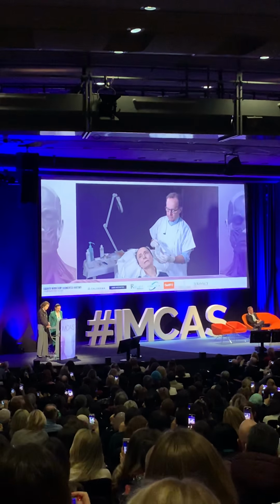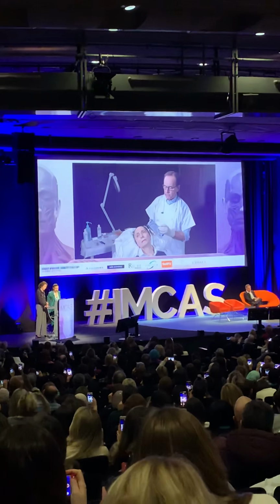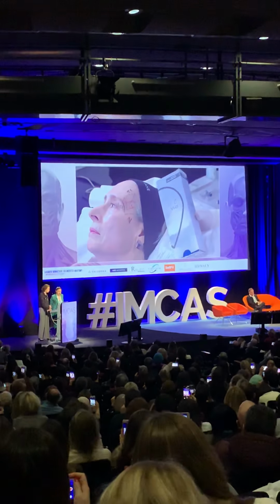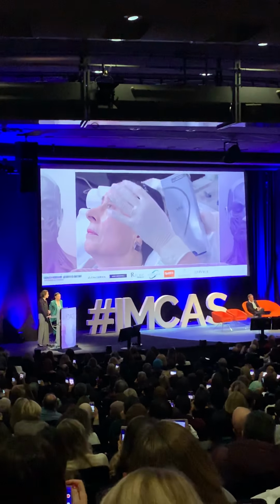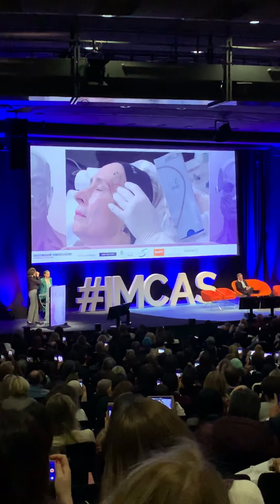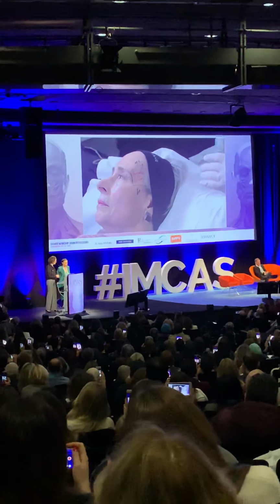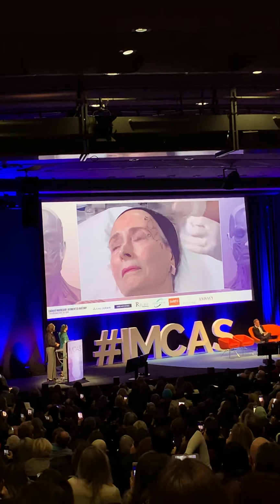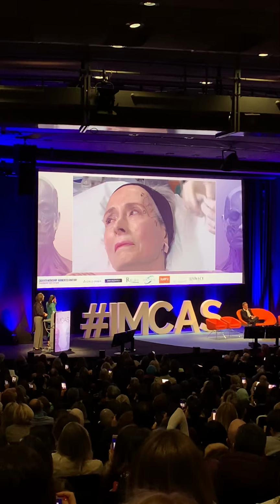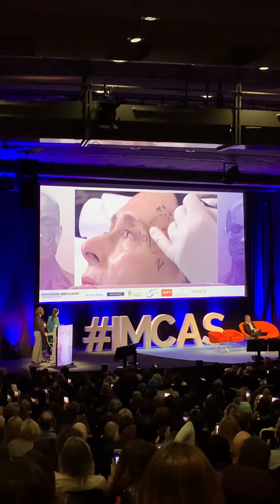I use a soft field cannula, and I will use a very soft product, and I use RH2 if I need a superficial injection. Because of the softness of the product, it spreads everywhere and you will not feel any bump. This is the issue when you do a superficial injection in the temple, because the skin is very thin, and so if you are doing a superficial injection here and you put a high cohesive product, then you will have the risk to feel or see some bumps here around this area.